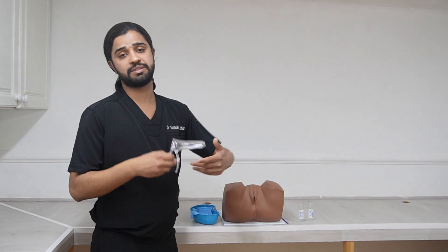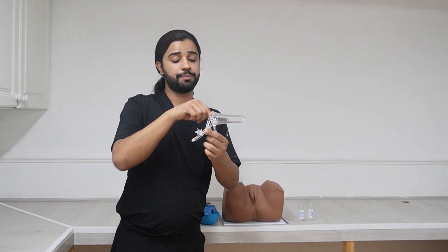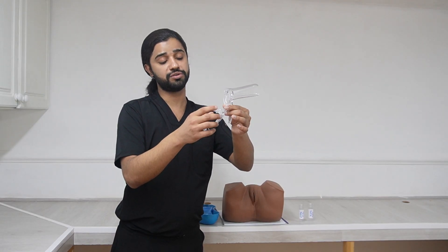First of all we need this speculum. This is a Cusco speculum. It has three parts: these two are the blades, then this is the back handle, this is the front handle, and this is the loosening and tightening nut.